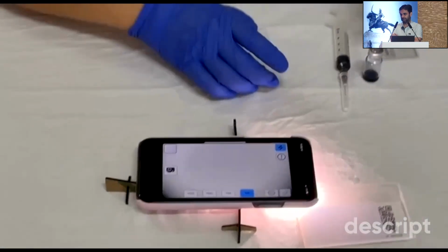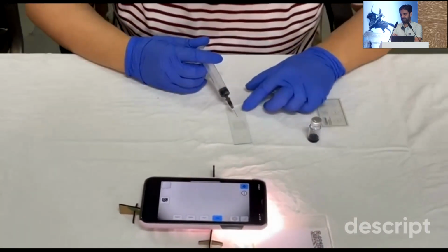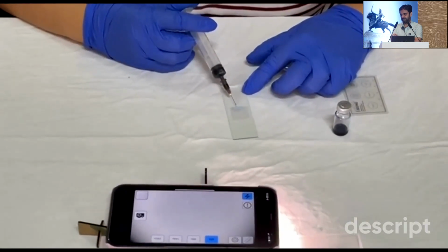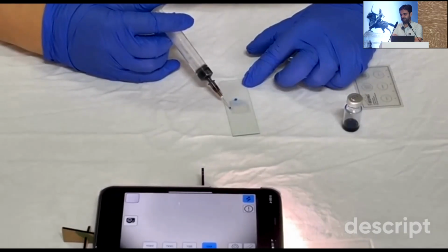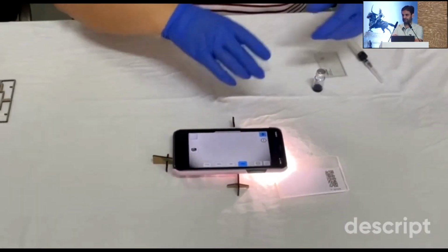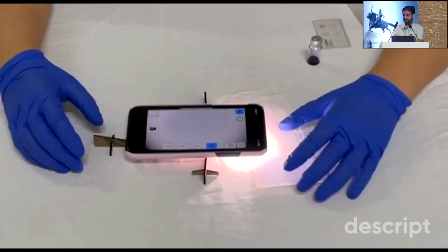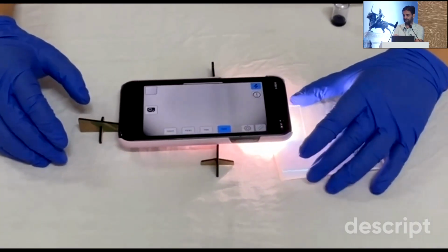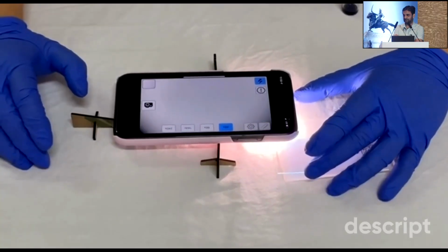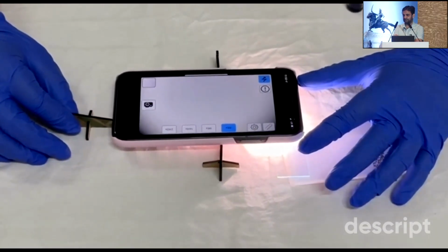Next, a specimen slide containing the corneal scraping is stained with trypan blue dye. Using a syringe, 1 or 2 drops of dye are carefully applied onto the slide. One can use the OT leftover trypan blue dye used in operation theatre for capsule staining during cataract surgery to minimize the cost of dye. This stain provides excellent contrast and highlights the fungal filaments beautifully, making them easily visible. It takes only about 30 seconds for the stain to act.